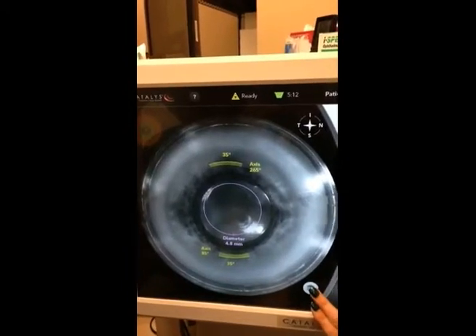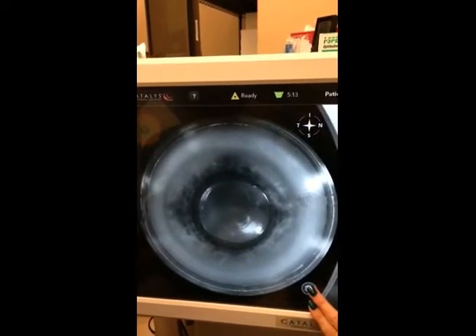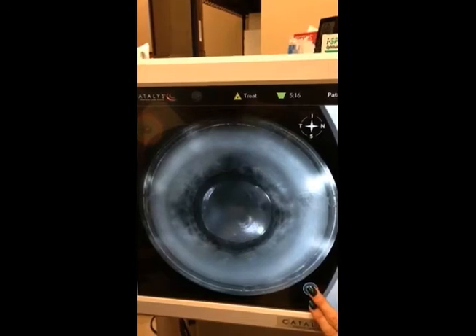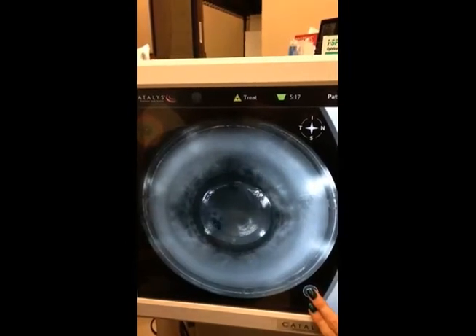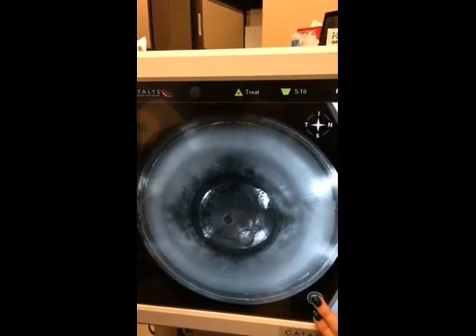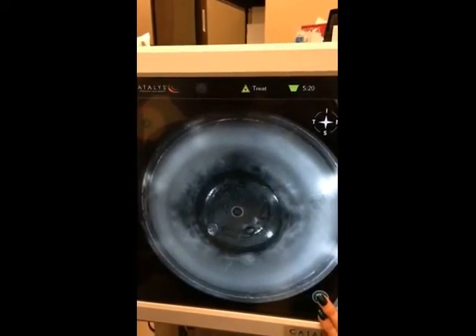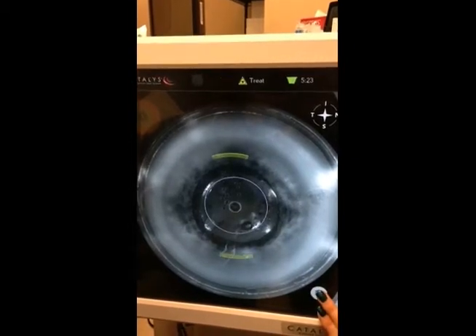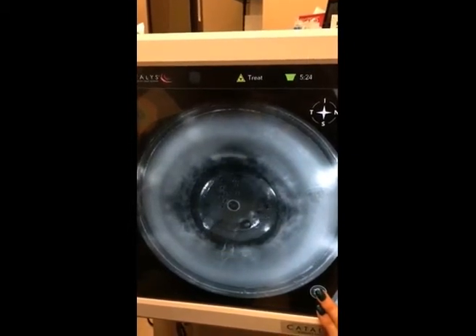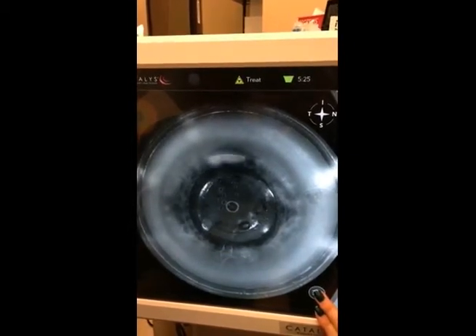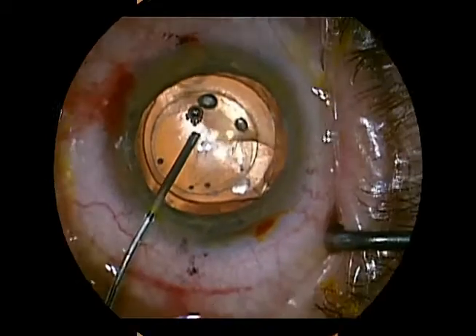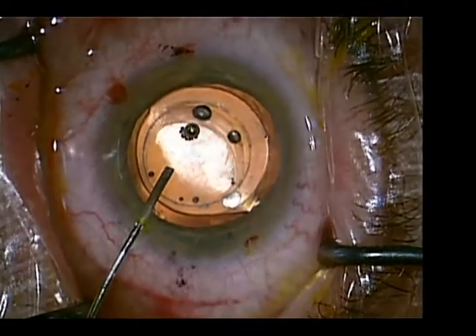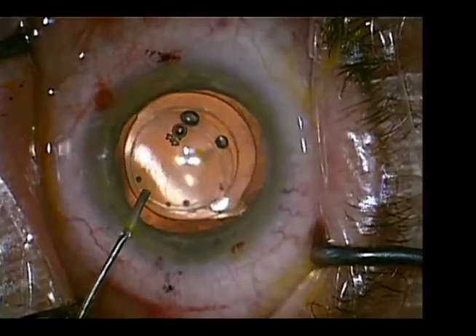In keeping with the method described by Surendra Bosti, the phymotic and fibrotic anterior capsule is treated with the catalyst femtosecond laser to create a new capsulotomy, and relaxing incisions are produced to reduce astigmatism.